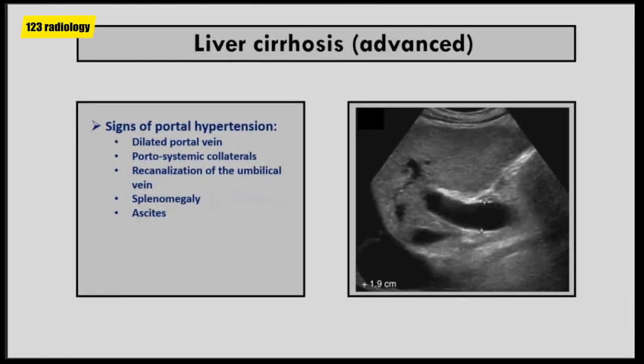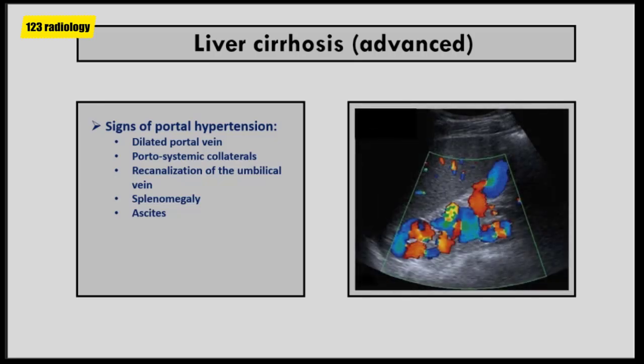In advanced liver cirrhosis, as a result of fibrosis, portal circulation resistance is increased, resulting in portal hypertension. One of the first signs of portal hypertension on ultrasound is increased diameter of the portal vein greater than 13 mm with lack of respiratory variation. Other signs of portal hypertension are dilated portosystemic venous collaterals, which can be seen at the perisplenic region and around the gallbladder. On ultrasound, collaterals appear as multiple anechoic serpentine structures that communicate with each other, showing venous flow on color Doppler.